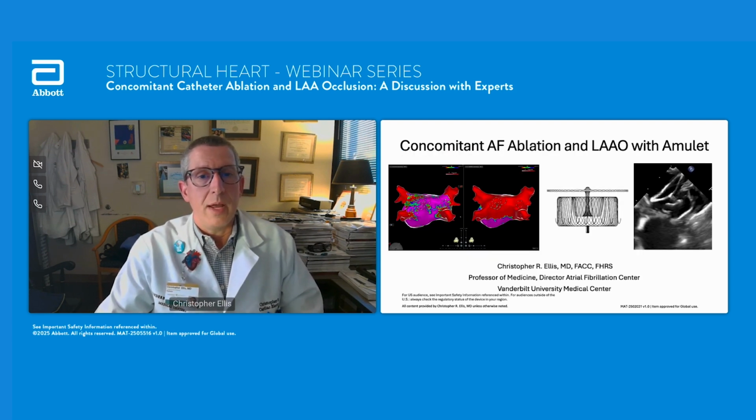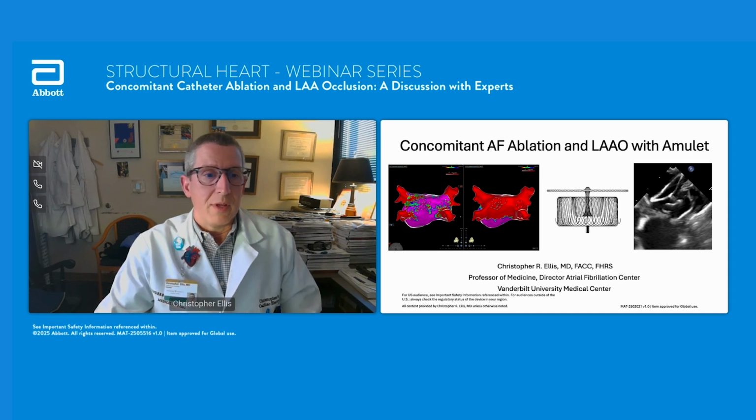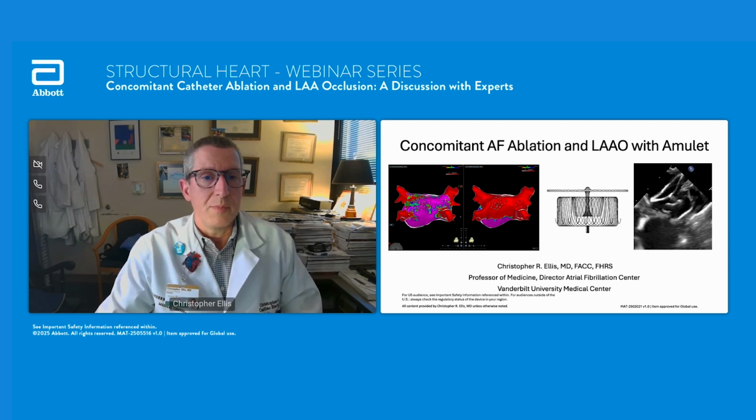So concomitant AF ablation and appendage closure with Amulet really is a fairly recent thing. Honestly, I had not done a whole lot of combined procedures with Amulet specifically outside of the OPTION trial and an occasional, relatively rare Watchman 2.5 case where somebody really needed both somewhat urgently. Most of the cases we are doing combined procedures on now are either patients who are sent for appendage closure and haven't had their AFib treated, or, what we're seeing now is a bit more of a push from the younger, lower CHA2DS2-VASc patient who wants the ablation but doesn't want to be told afterwards that they have to continue anticoagulation indefinitely.